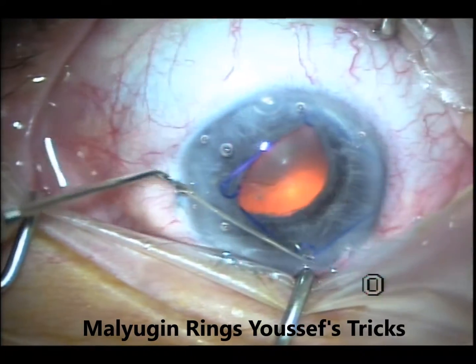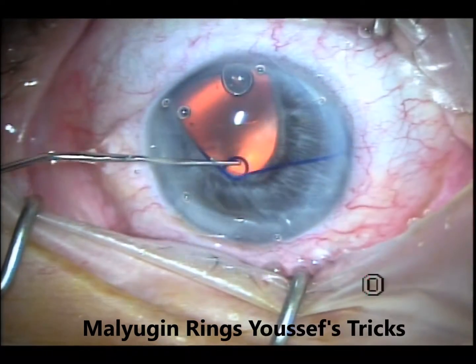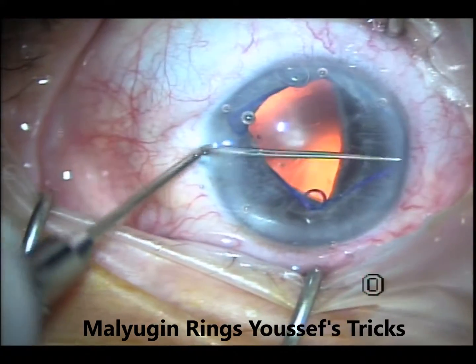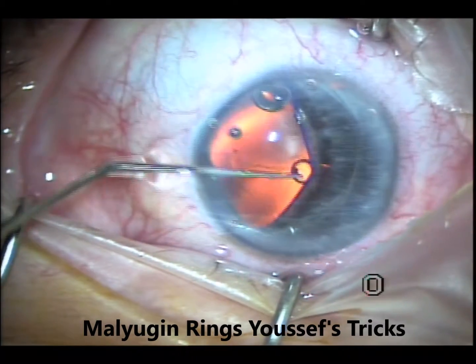This is a Lester hook. I engage the sub-incisional one first and go through the more difficult ones after that. You start with the more difficult ones and then leave the easy ones, which is usually the nasal one, to the end.